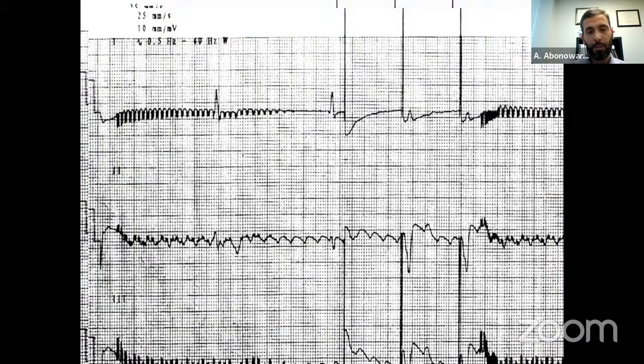This is a patient in surgery, and there's interference from the electrocautery. So we have to be careful when we use cautery, because it can interfere with the pacemaker and cause interruption to the electrical activity.